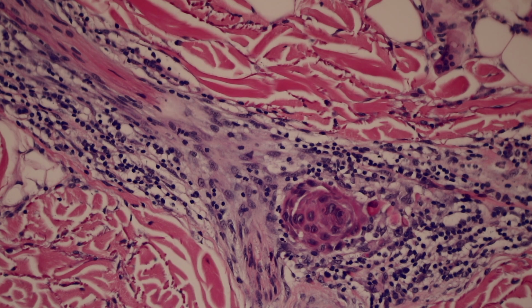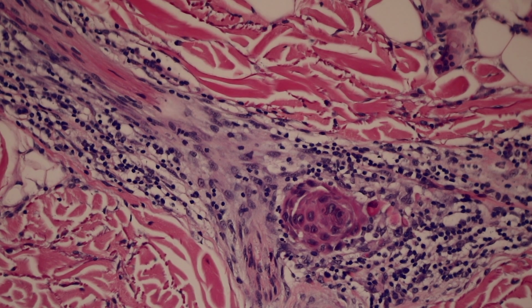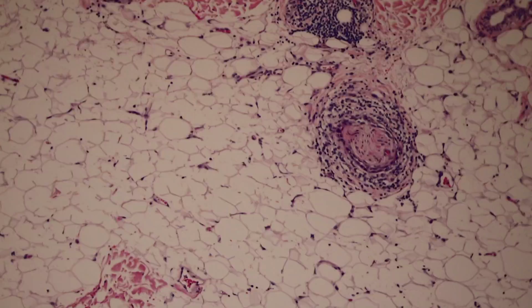clinical team. The other reason is that anytime you have perineural invasion, there's potential that the tumor has extended out beyond the margins. So you might have negative margins, technically, like you've looked at all the margins and they're negative, but there still could be tumor that's skipped past the margin along the nerve and is still there in the patient. I've seen that before, a patient that was cleared by Mohs and then had a recurrence. They were cleared by Mohs again, then they had a recurrence. And then finally we looked at the Mohs permanent sections, couldn't find anything but cut deeper, and after the clear layer, there was a nodule of perineural invasion. To me, that was a perfect example that really helped me understand how perineural invasion can behave clinically.